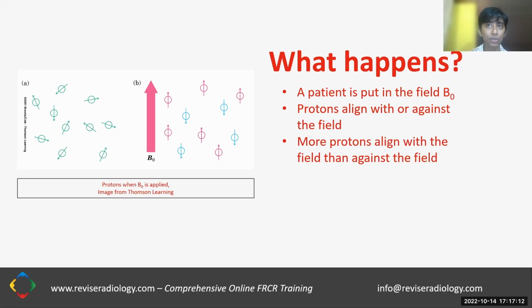You might be confused at this point because if you've ever played with magnets in your life, you'll know that in the presence of another magnet, they only ever align in the same direction. So why is it that these magnets can either align in one direction or the opposite direction? The reason is that the magnets we're talking about here are quantum magnets, so we have to expect them to behave in ways that are different from classical magnets.